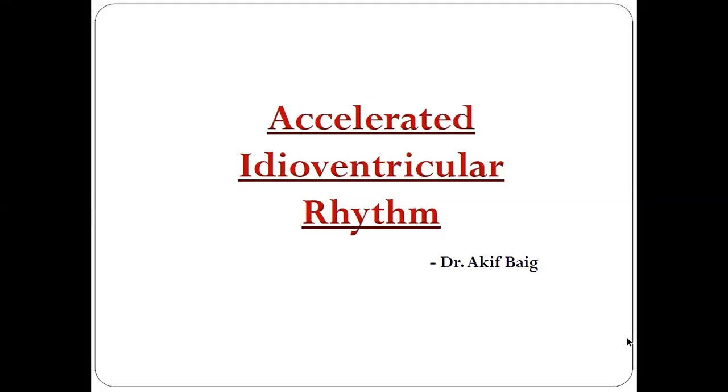Hello everyone. Today we'll be talking about accelerated idioventricular rhythm and the ECG changes in it.